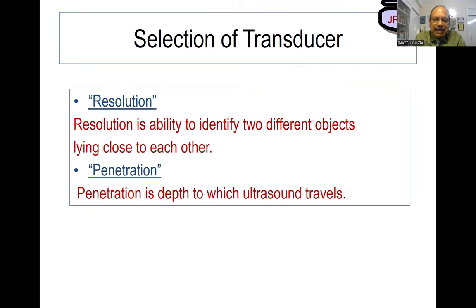And when the car is standing right in front of you, you can say what the size of the light is, what the difference between these 2 lights is, what the texture of these 2 lights is. So the car, when it's standing close to you, has the highest resolution. And when it's away from you, that's the poorest resolution.